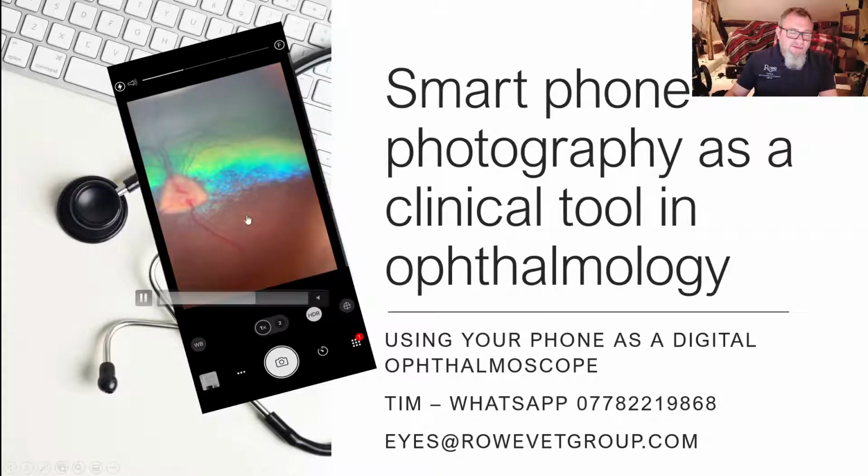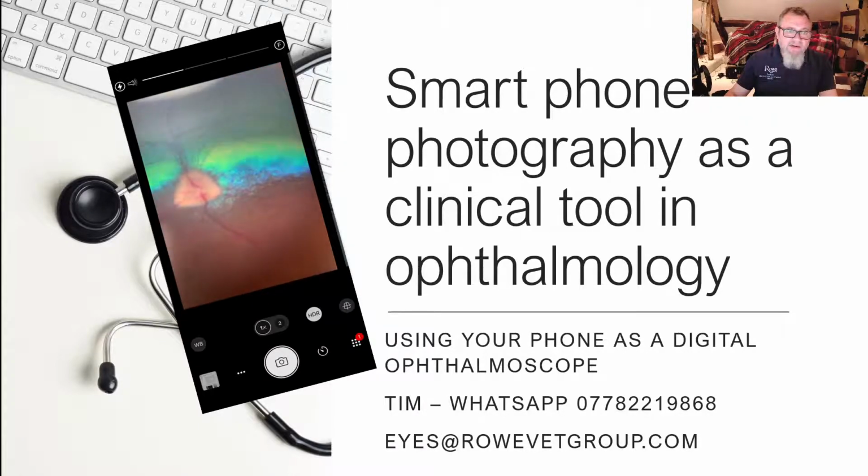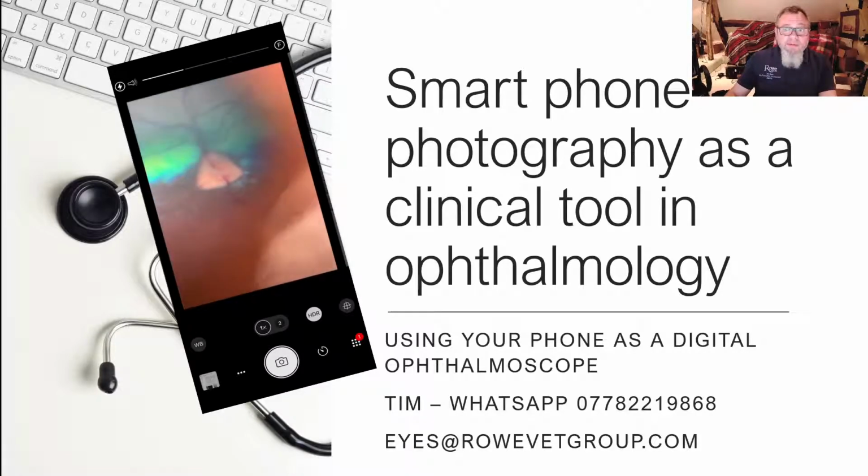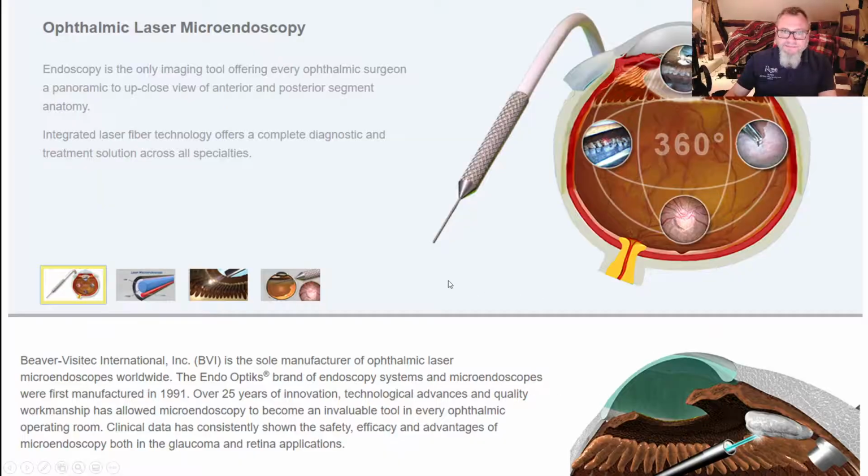So this little video clip we're showing you is the optic nerve head of a normal dog. If you look closely, you should be able to see the pulsing retinal arterioles, and these images should be easily accessible with most mobile phones. So we're going to give you a few tips as to how to get them today.